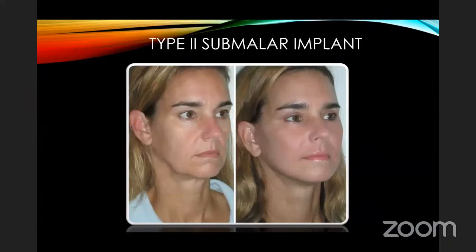So here's a patient that I did upper and lower blepharoplasty. I did a small facelift, and I did cheek implants. And the thing that really sets this post-operative result off is the cheek implants. If I just did the facelift and the eyelids, this patient would not have had this level of rejuvenation. So it's extremely important to appreciate what cheek implants can do for your case.